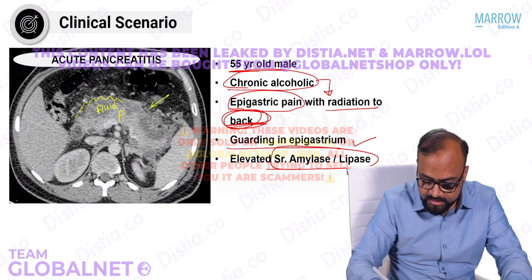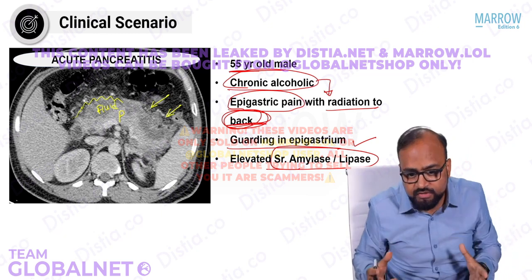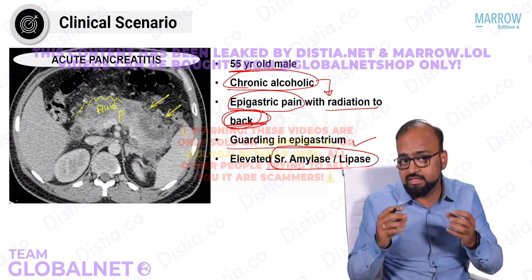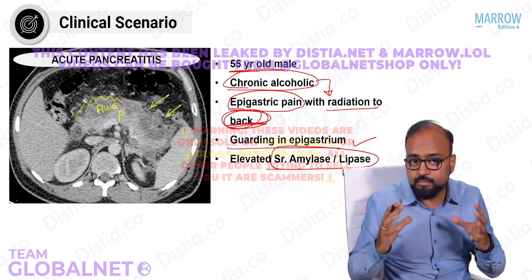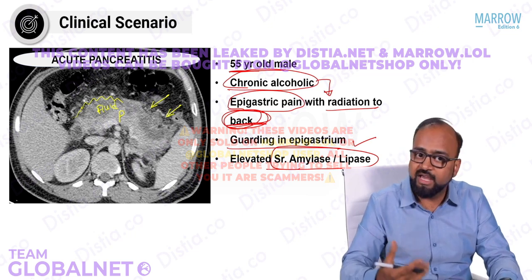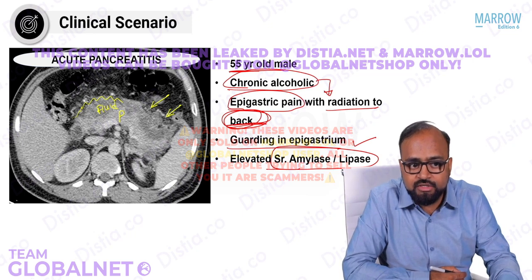The peripancreatic mesentery is showing significant fat stranding. Margins are irregular, it is fuzzy. It is showing enhancement at this stage, right? We have to look whether there are any non-enhancing areas in the parenchyma that could signify necrosis. So enlarged bulky pancreas with fuzzy margins, right? Fluid collections, fat stranding around it. All these are features of acute pancreatitis. Clinically, these are all very classic features of pancreatitis.